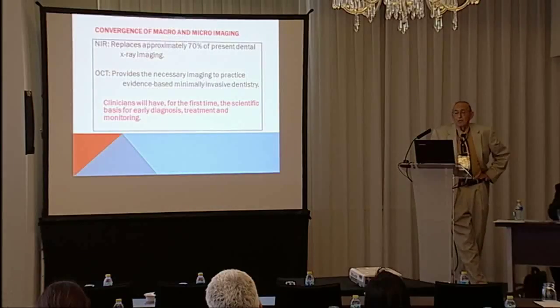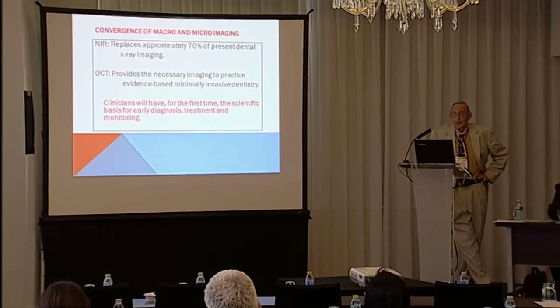NIR replaces approximately 70% of dental X-ray imaging. OCT provides the necessary imaging to practice evidence-based, minimally invasive dentistry. Clinicians hopefully will have, for the first time, the scientific basis for early diagnosis, treatment, and monitoring.